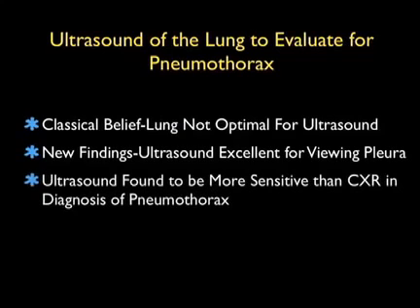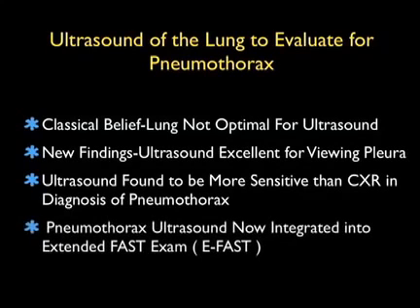There's been a lot of research looking at this, and what's interesting is that ultrasound has now been found to be more sensitive than chest X-ray in the diagnosis of pneumothorax, especially in the supine trauma patient. And now we're going to add on views of the lungs looking for pneumothorax as part of our extended FAST exam, or the eFAST exam that we'll be performing in trauma patients. We can also detect pneumothoraces in our medical patients.